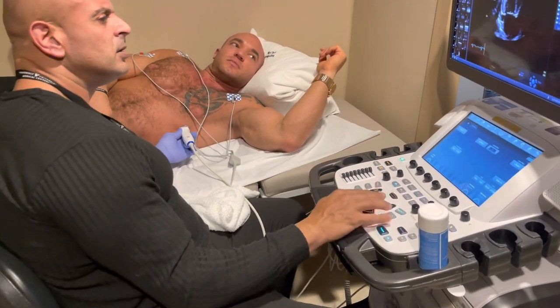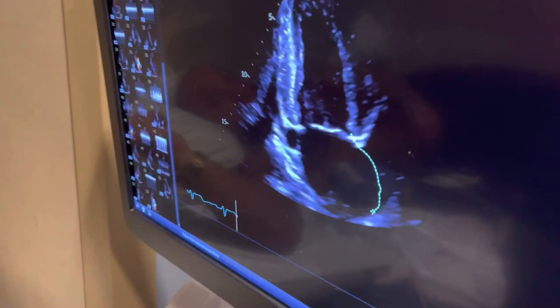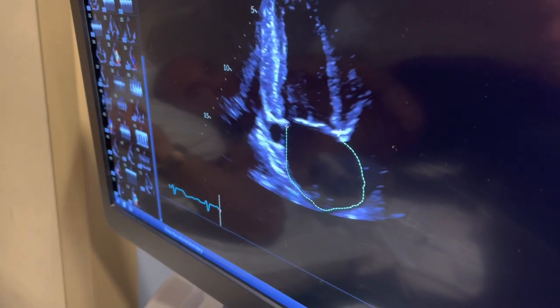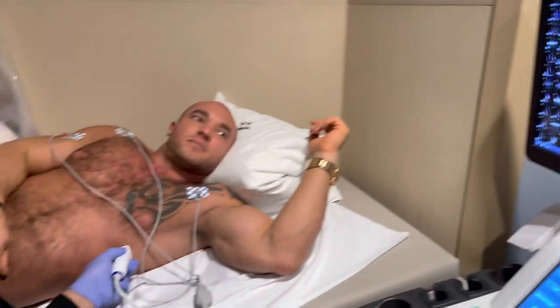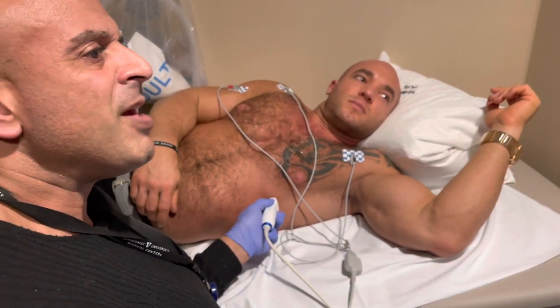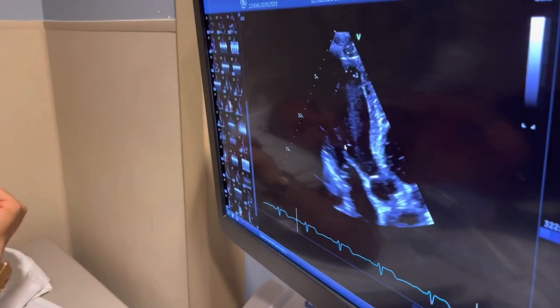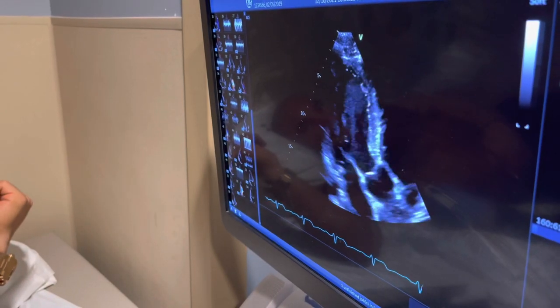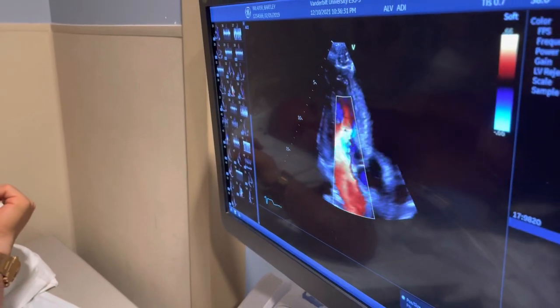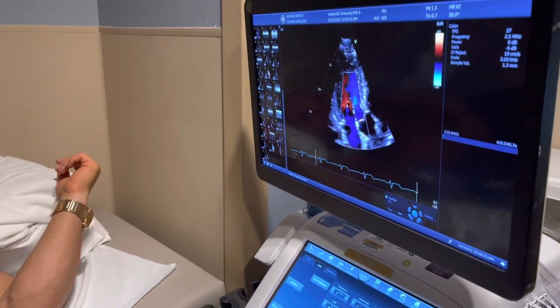We're measuring this chamber again — just the volume, this is the receiving chamber. We're basically looking at the same exact things from different angles. The way his ventricle is squeezing — very, very normal. Everything looks really good. Perfect function. Valves look perfect. Nothing leaks, no regurgitation.